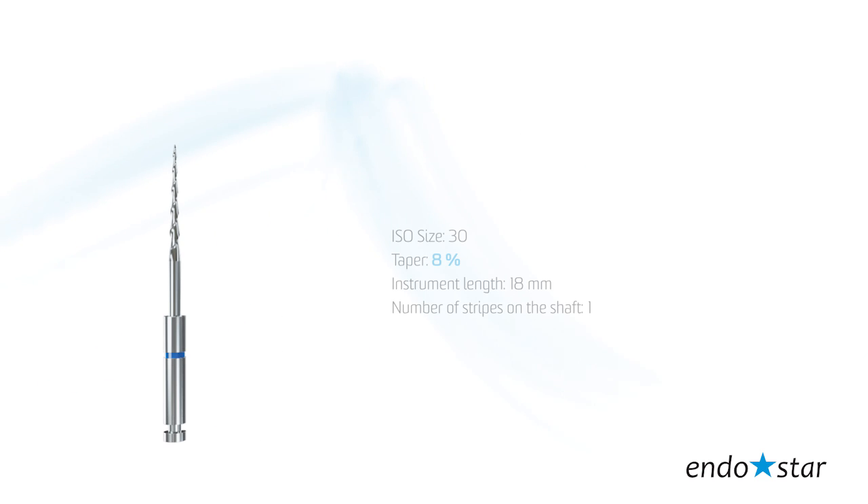File number 1, the so-called opener, is used for preliminary instrumentation of the canal orifice and coronal part of the canal. The tip size reflects 30 according to ISO standards. Taper, 8. Instrument length, 18 mm.